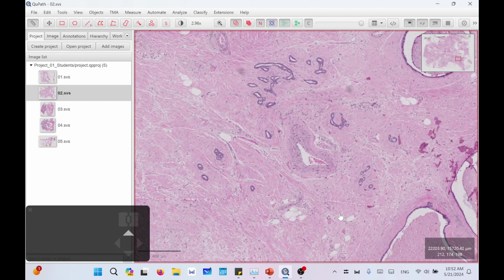So this step is crucial and requires concentration in the annotation process. The reason behind that is, assume that a region is a tumor and we are annotating it as a tumor, but the annotator took a large region that consists of tumor and non-tumor parts. Later, when we provide that to the system, the classifier or the model is misled because it got data that it thought to be a tumor but contained non-tumor parts. So we need to focus on the annotation, or the doctor needs to focus on the annotation process to be precise and concise.